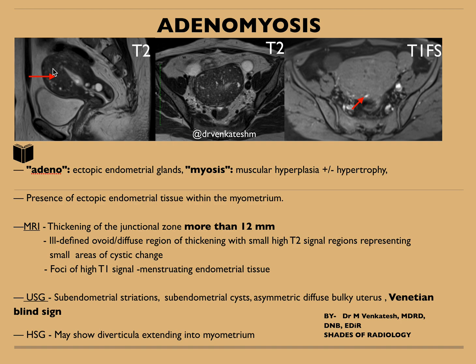Let us first look at the case. This is a sagittal T2 weighted image in the mid-sagittal plane, this is the axial T2 image, and this is the T1 fat sat image. You can clearly see the entire uterus is showing globular enlargement and asymmetric thickening of the anterior and posterior myometrium. You can see multiple tiny cystic T2 hyperintense areas in the sagittal as well as axial images. On the T1 fat sat image, you can see a few T1 hyperintense foci, which are suggestive of hemorrhagic foci — nothing but endometrial glands. So this is a classic case of adenomyosis.